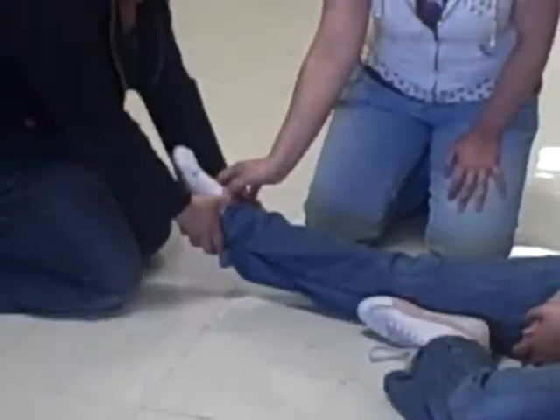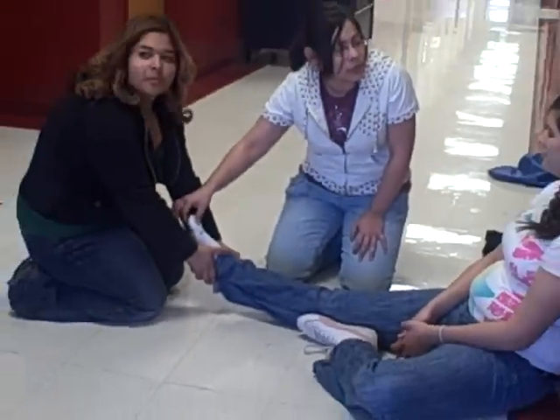I'll check for PMS, which stands for Pulse, Motor, and Sensory. Do I have a pulse? Pulse is present. May I have you wiggle your toes? Which toe am I touching?